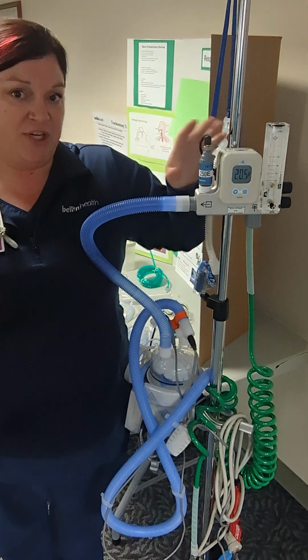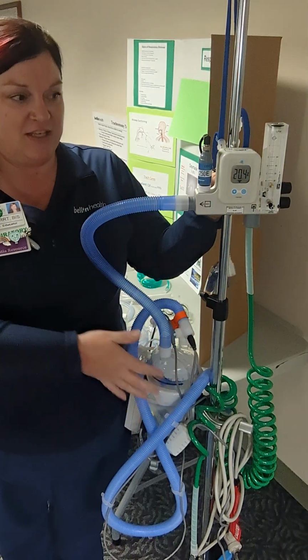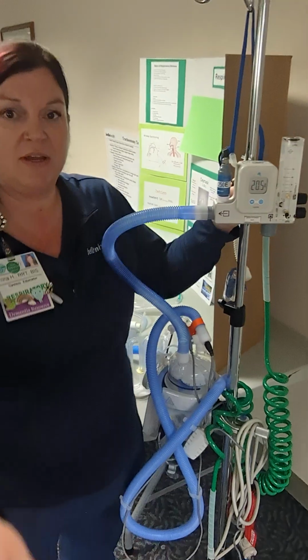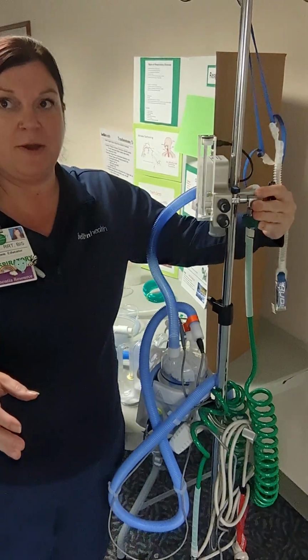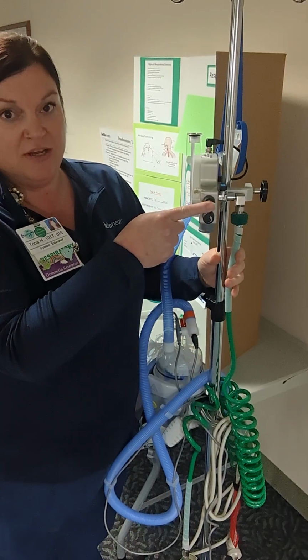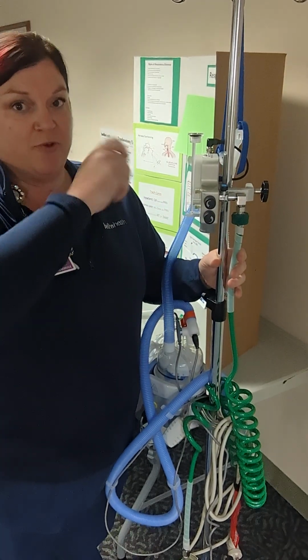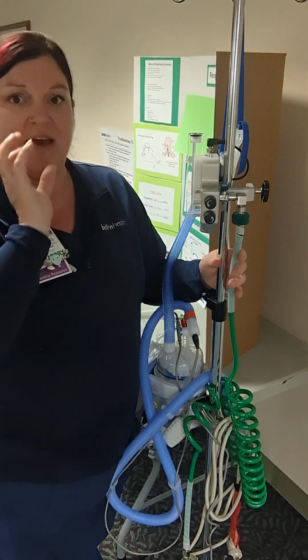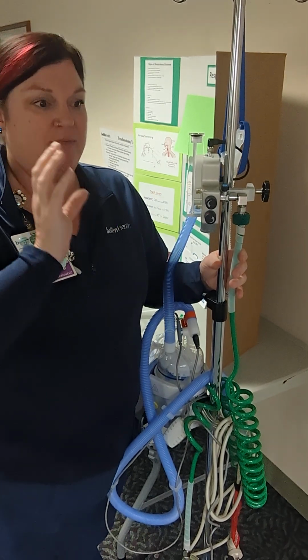So on this machine, we have two things. Besides the heated humidity setup, we have two controls here on the side. We have oxygen and we have flow. So instead of just cranking up a flow meter and doing the math and based on the way a patient's breathing, are they getting that much FiO2?